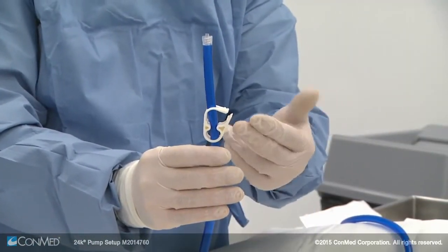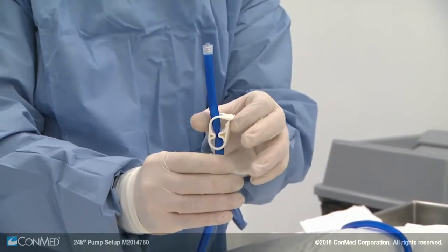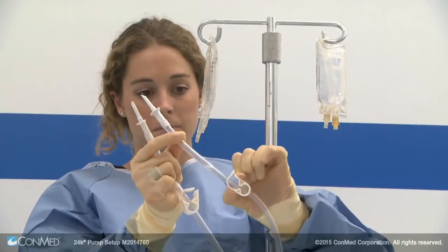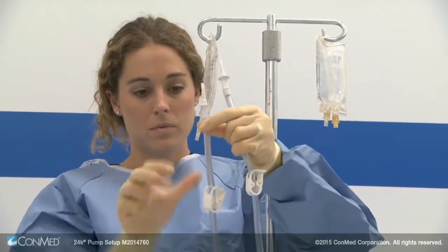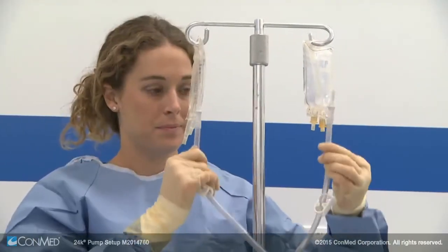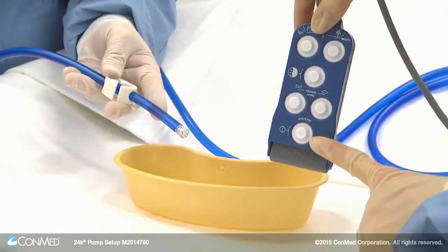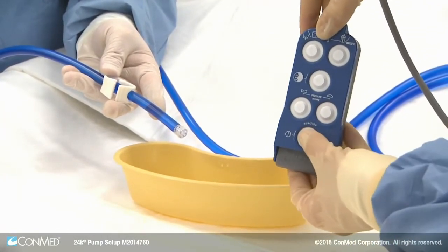Before starting a case, make sure the white fluid clamp on the blue inflow line is open — never close it before starting the case. To spike the fluid bags, take the two clear bag spike tubes and close the white fluid clamps, remove the bag spike covers, and spike the bags. Now you can open the clamps and prime the inflow line.